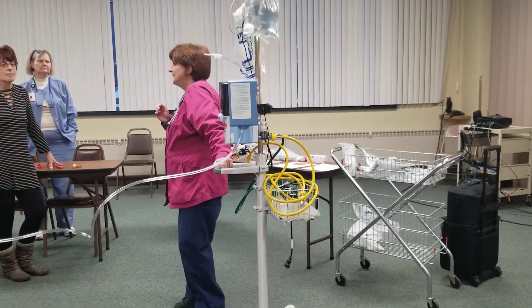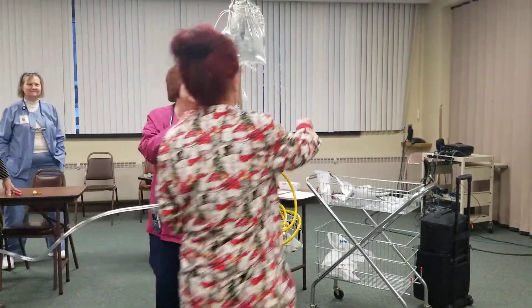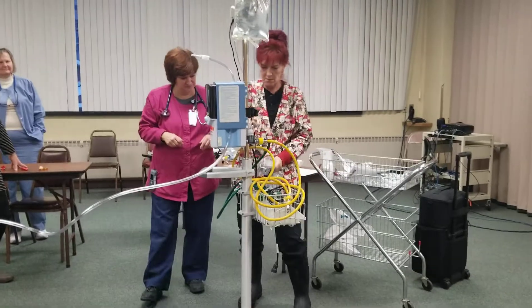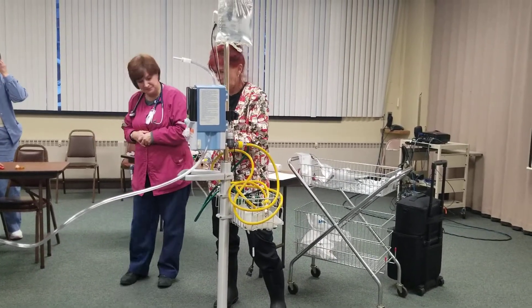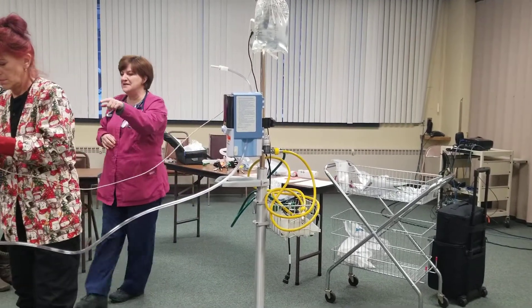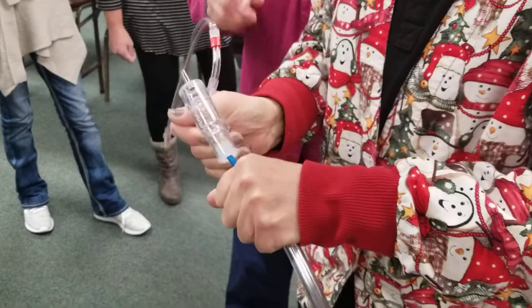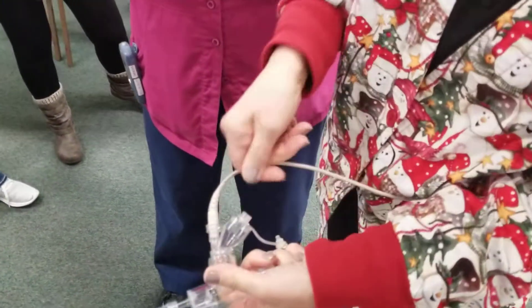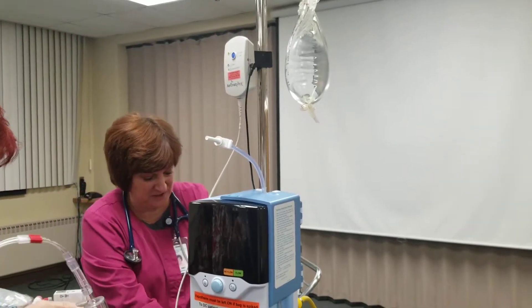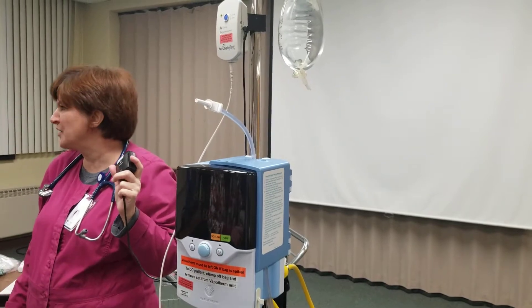Now the doctor has ordered a nebulizer treatment. How do I do a neb? She's putting it in — it doesn't matter which way it goes, it can go in any direction. Dump the medicine in there and turn it on. Make sure it's plugged in — it needs to be plugged in. Then turn it on and the light comes on. It lasts for about 30 minutes.